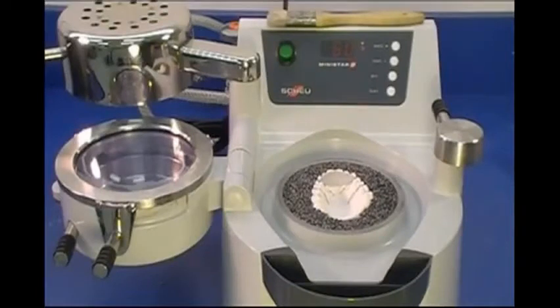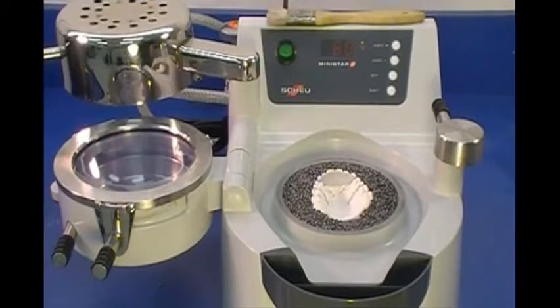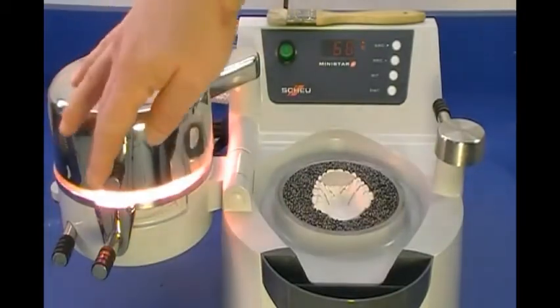Select a 2mm BioAcryl disc. A variety of colors and pattern designs are available. Clamp the BioAcryl disc onto the chamber. Identify the material's heating time or BioStar code and enter it into the machine. Swing the lamp over the clamp material to start the heating cycle.